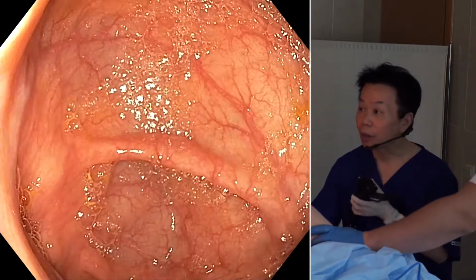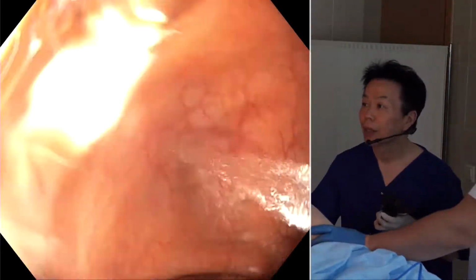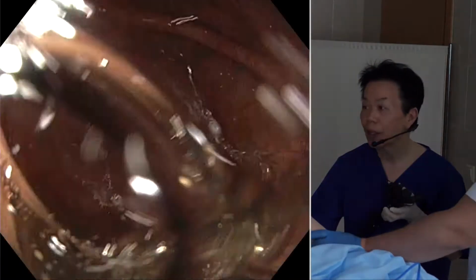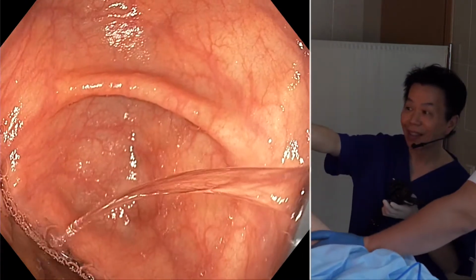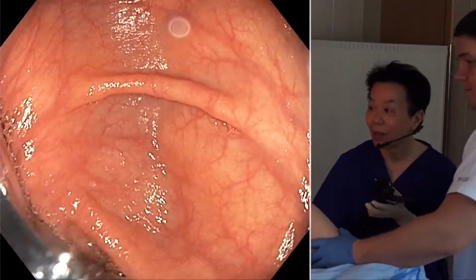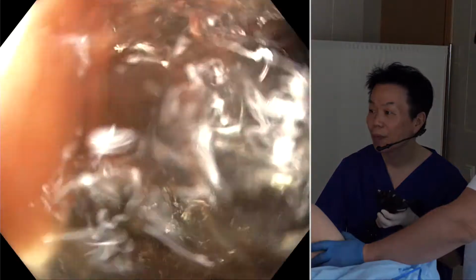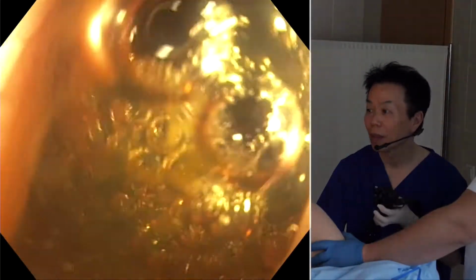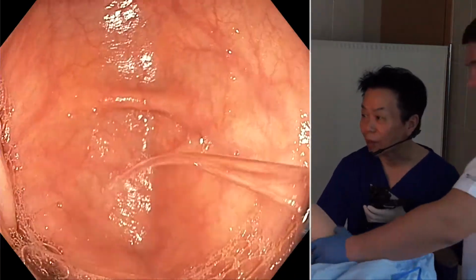And can I have the water jet? Yes. And washing off still residue and bubbles are very important. Washing and sucking residue is very important.